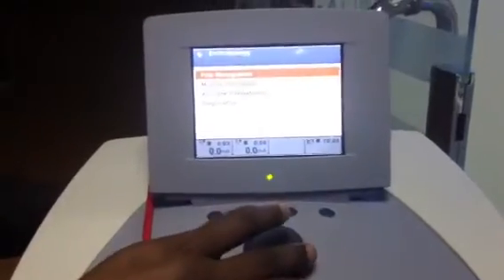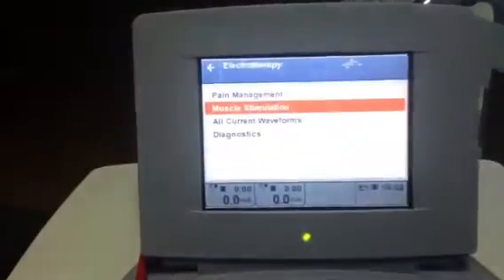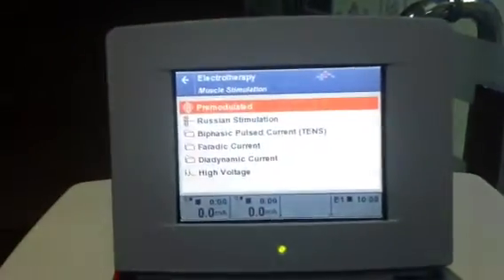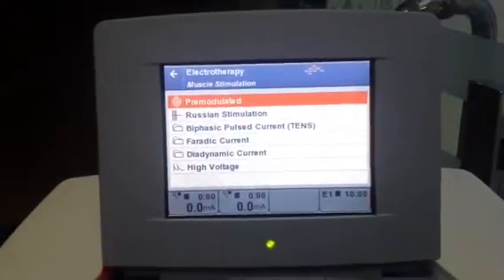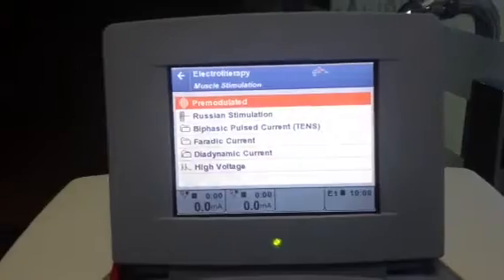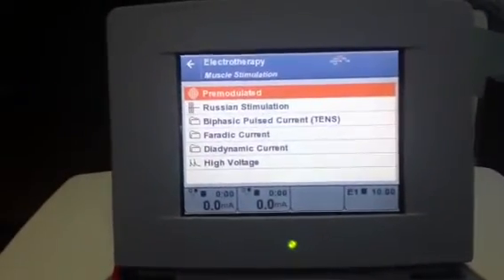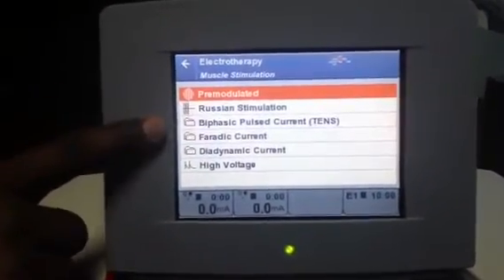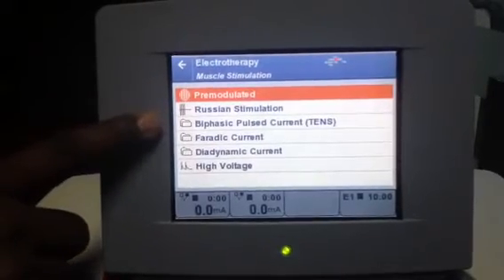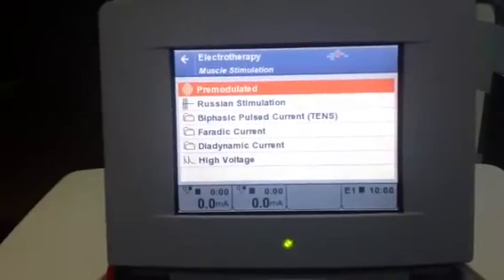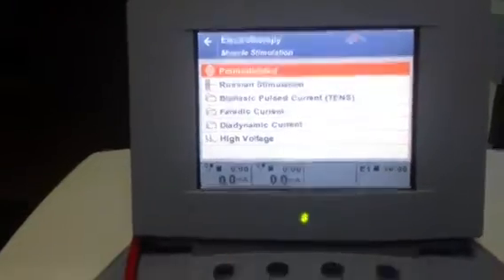Go back and select Muscle Stimulation. This option is for stimulating the muscle. The best currents to stimulate the muscle are listed here — for pain you have a longer list, but for stimulation only these currents are important: Faradic, Russian, Biphasic, TENS, Diadynamic, and High Voltage. These are the stimulation currents.